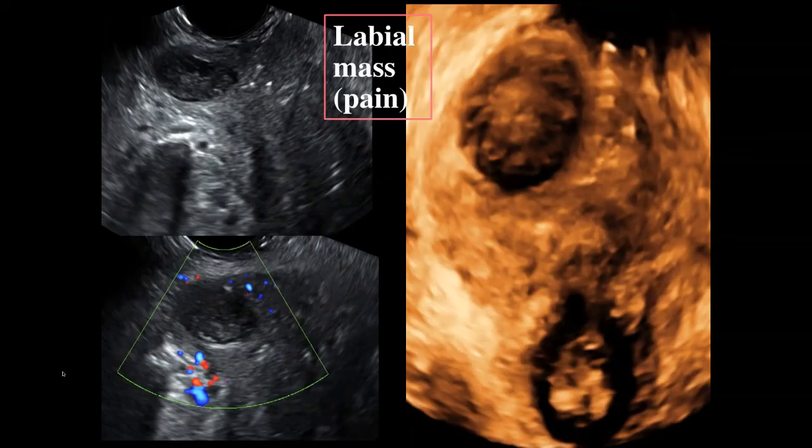Okay, so this was a patient who came in with a lot of pain in her labia. And so here is the mass. Again, it's solid, although it doesn't have any color in it, really, that I could detect. It was pretty close to the introitus here, and it was very tender. And in 3D, you can see its location is to the side of the vagina and urethral region right here. And this turned out, I had no idea what it was. It went to surgery. This was an endometrioma, an endometrial implant in that location.